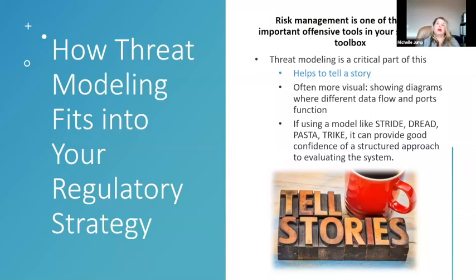So this first section is really, how do you use threat modeling to augment your regulatory strategy for submissions that are relevant to cybersecurity? And I think most people who've had experience with submissions or even working in a regulated space know that risk management is a huge part of any submission toolbox, any audit. Risk management is really where you're doing a lot of really important work, where there's a lot of focus.